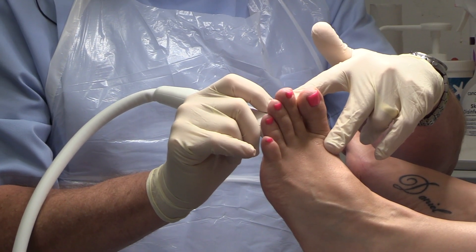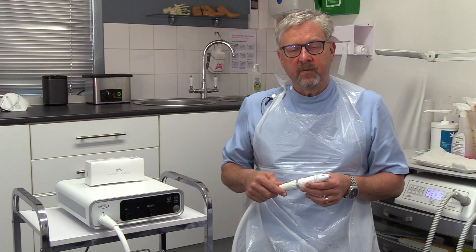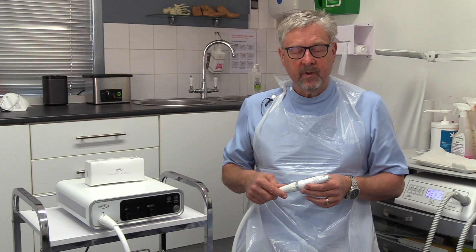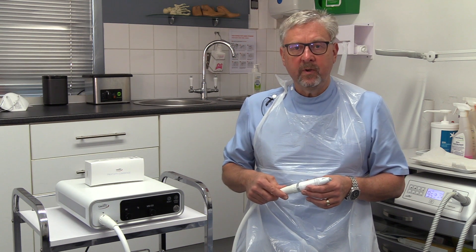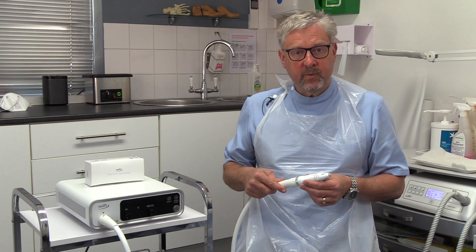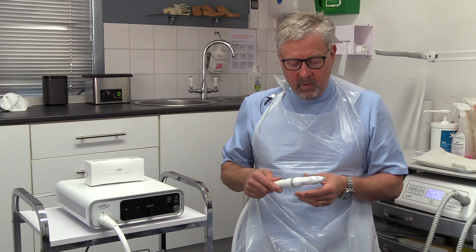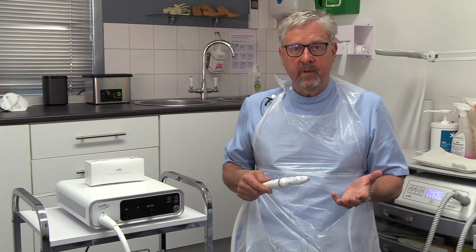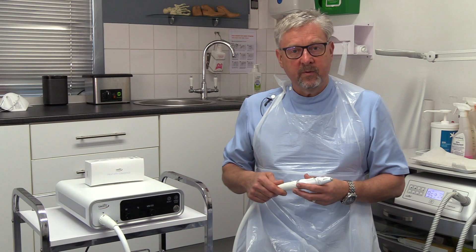One of the great things about Swift treatment is that it doesn't interfere with your daily life. A lot of the other treatments that we give in podiatry for verrucas mean that you have to wear dressings and keep the site dry. With Swift, that's not the case. Once you've had the treatment, you walk in, you walk out, you can go swimming, you can shower, your life goes on as normal.